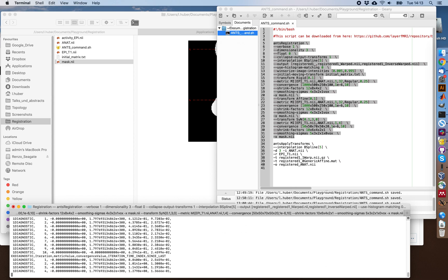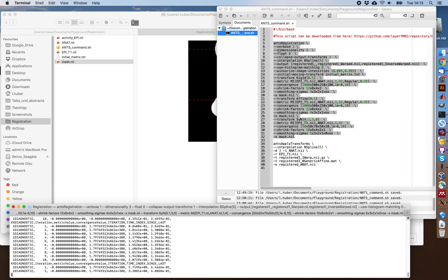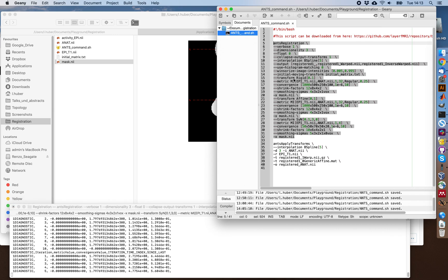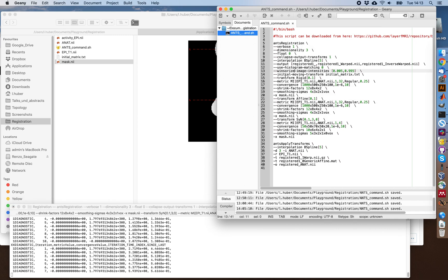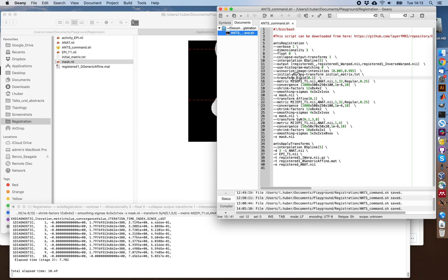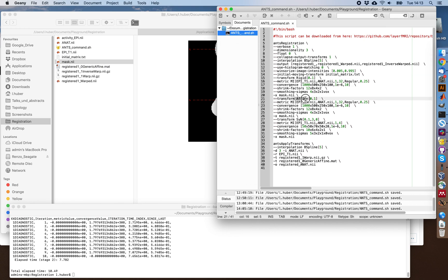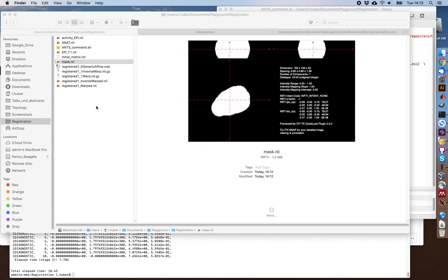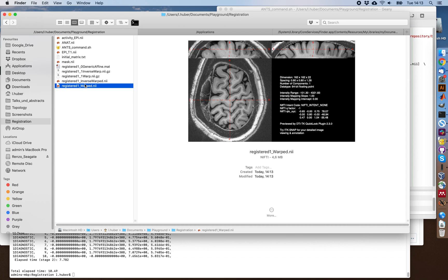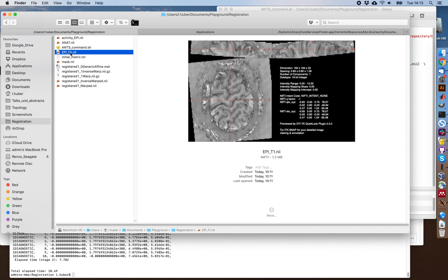This is doing alignment in three steps. The first one is an initial rigid transformation, then an affine one. And at the end, this very sophisticated nonlinear SyN registration. And this gives us a warped image, which would be this one that should now be aligned to our functional data.